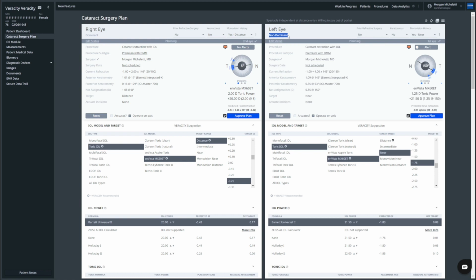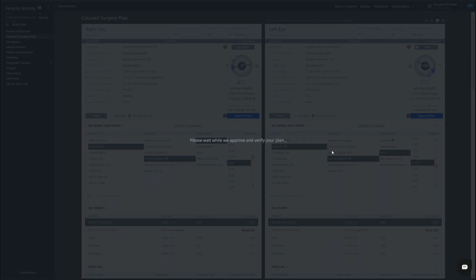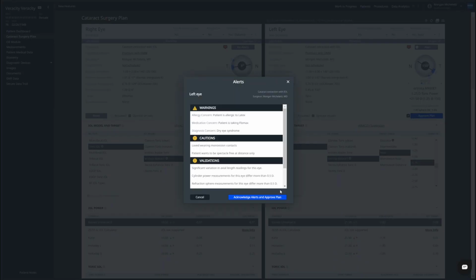And it shows right up here, non-dominant eye, right? So I know that this is the eye I'm going to put as my near eye. And you can manually adjust your target over here as needed. So pretty cool, the capabilities it can do. Now, of course, on my right eye here, I'm going to target a little closer to plano, given that it is my distance eye. There we go. And we'll do the non-dominant eye first for monovision.